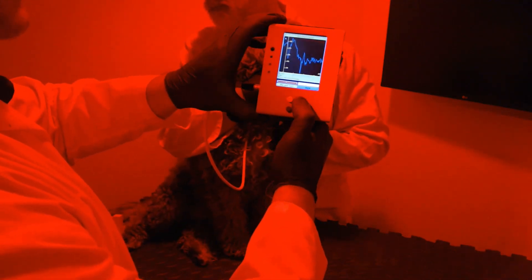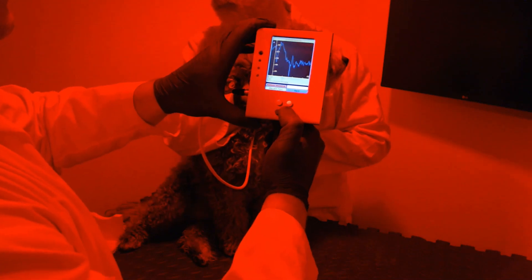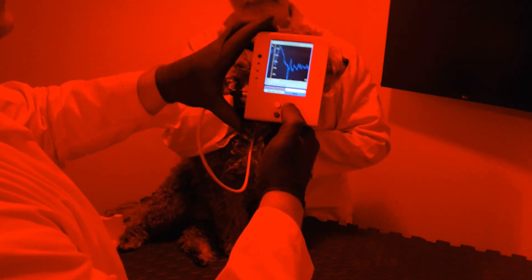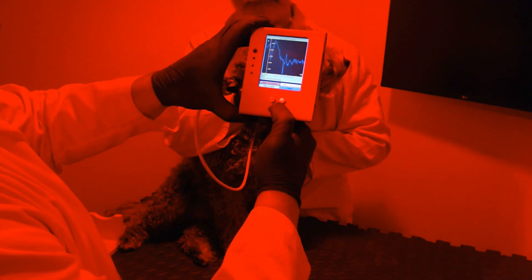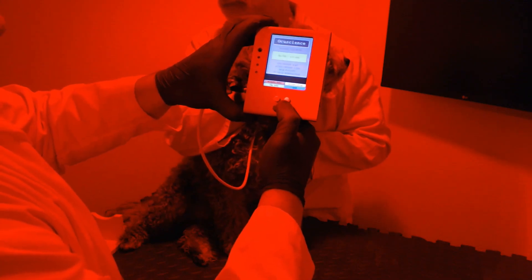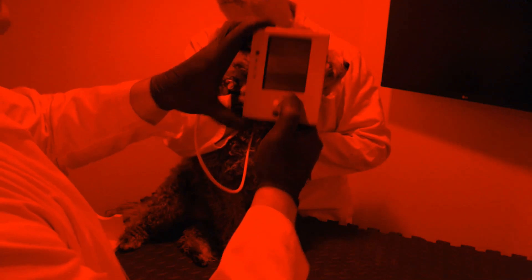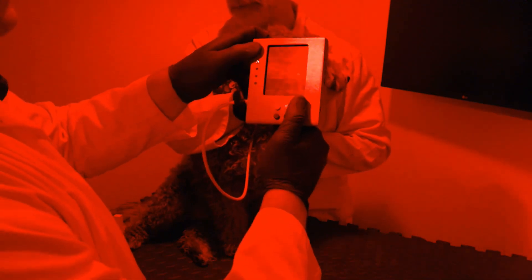The test will also automatically save to the CF card. One thing to be sure of is that before pulling the CF card out for post-processing, you press the back button, the back button again, the blue quit button, and then shut down. This will prevent any card errors from happening.